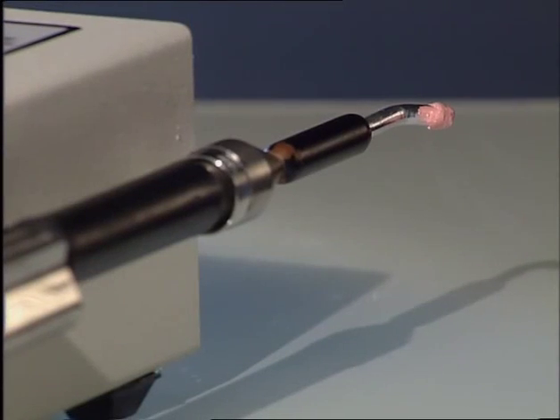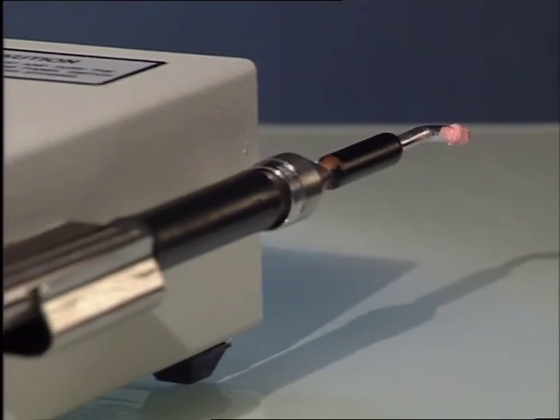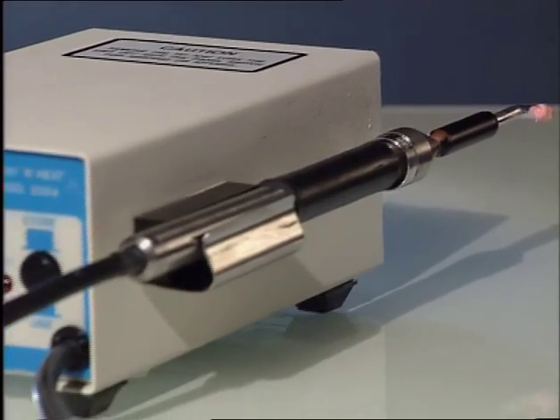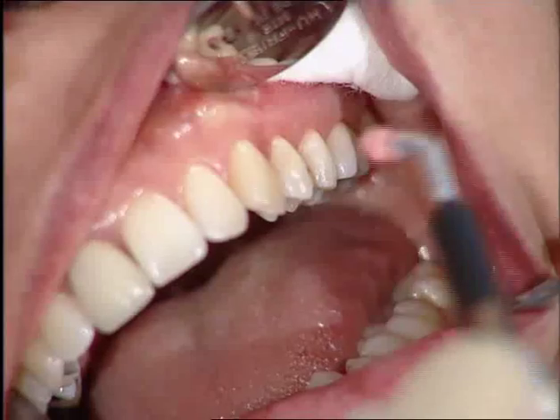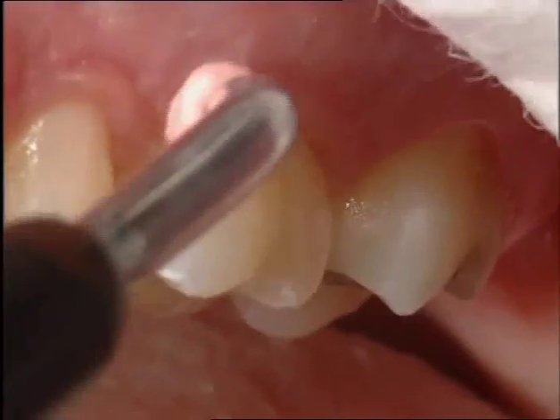The hot pulp test with heated gutta percha was done with the specific tip of the touch and heat instrument. The teeth have been isolated with Vaseline before, so that the heated gutta percha couldn't stick on their surface.